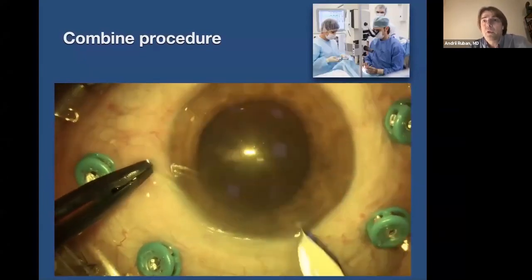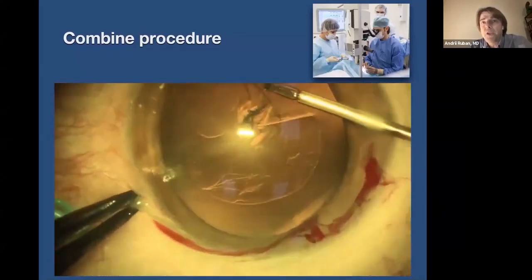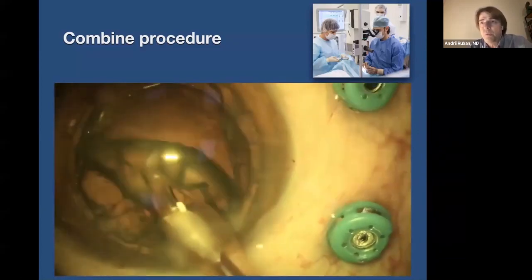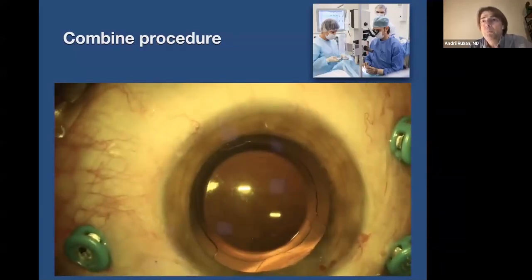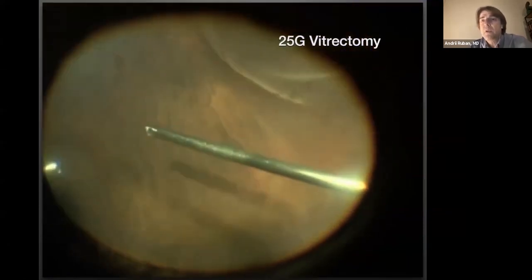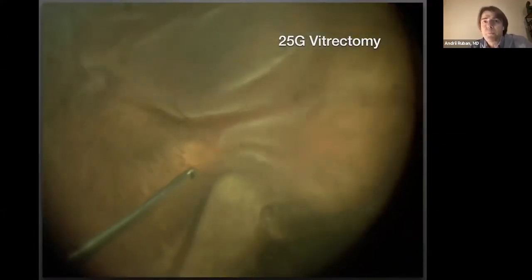Firstly, it's phaco vitrectomy. I believe in the benefits of combi surgery, both for patient and for the surgeon. I have been performing it in all my patients over 40 years old with reliable axial length. The choice of the IOL is determined by the perspective of improving vision after surgery. Basically, I use 25G vitrectomy, which in my opinion gives the optimal balance between the stiffness of the instrument, flow characteristics, and tightness of the sclerotomies.